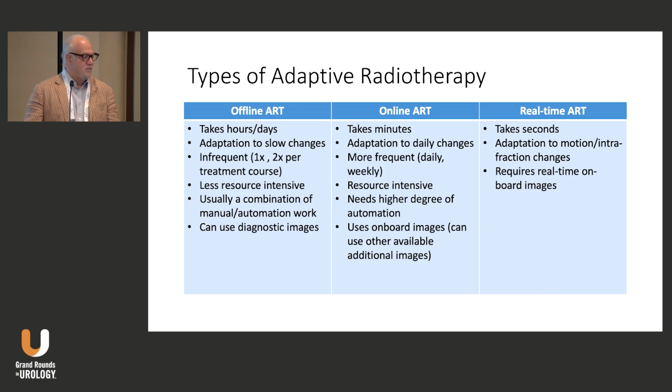And then there's the planning treatment volume, the PTV, which is basically giving a margin to the CTV or the GTV that we want to treat. So when I discuss with patients the main difference in prostate cancer between a prostatectomy, which essentially removes what we would call the GTV, the prostate, with very little or no margin, we can add as much margin to create what's called the PTV as we want to. We're only limited by the normal structures and their tolerance.